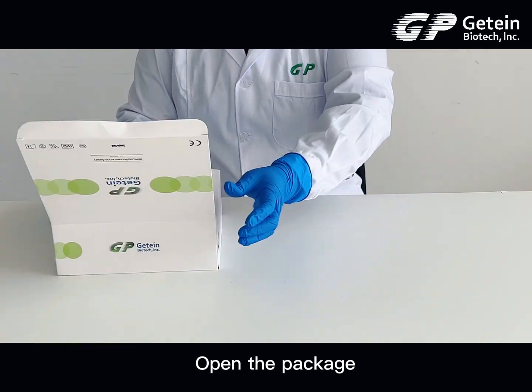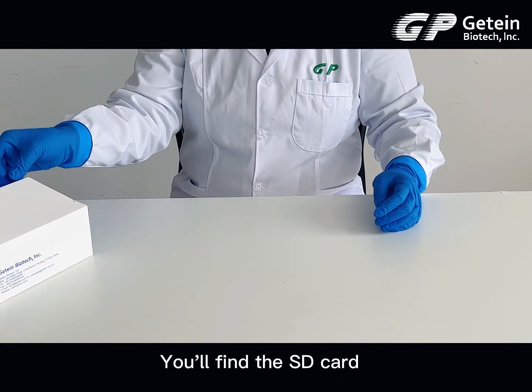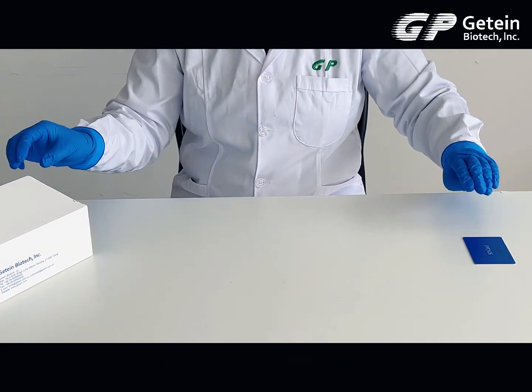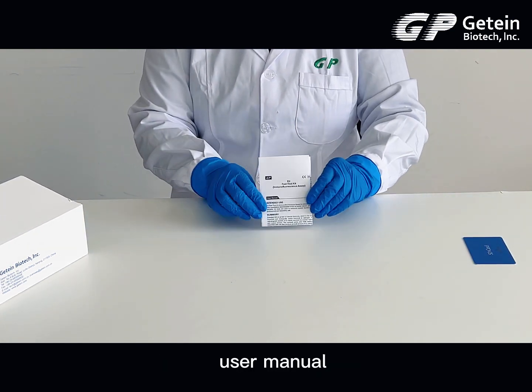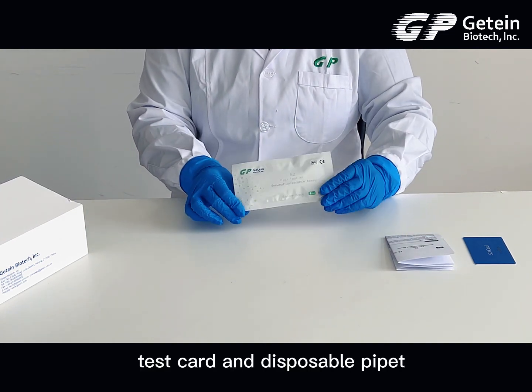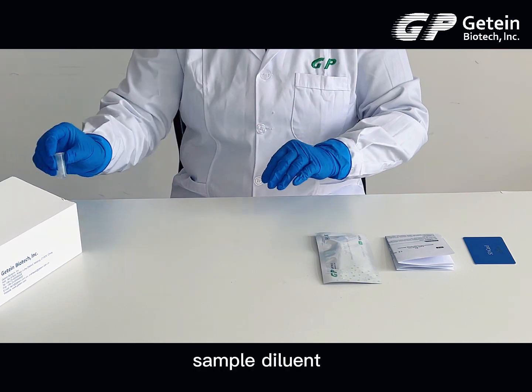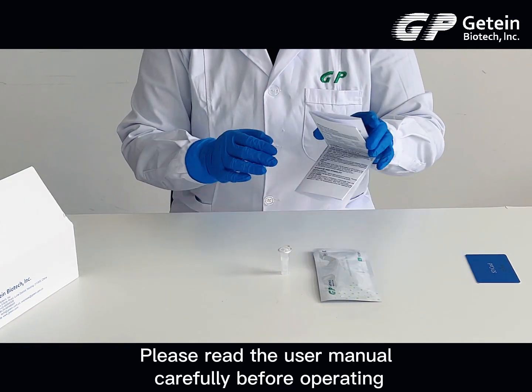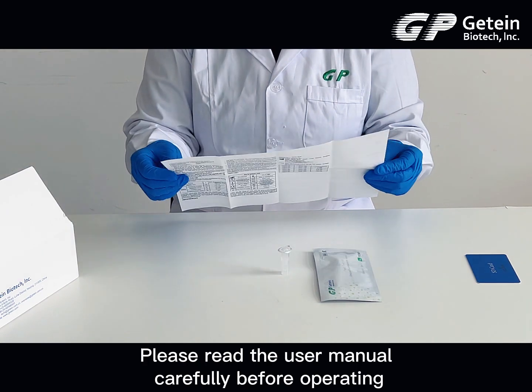Open the package. You'll find the SD card, user manual, test card and disposable pipette, and sample diluent. Please read the user manual carefully before operating.